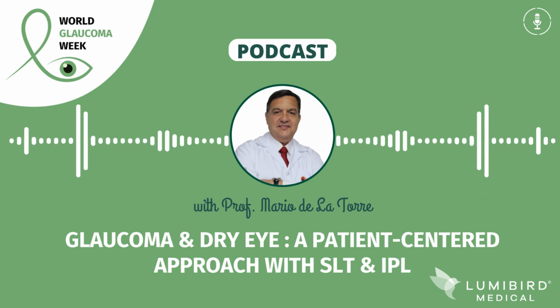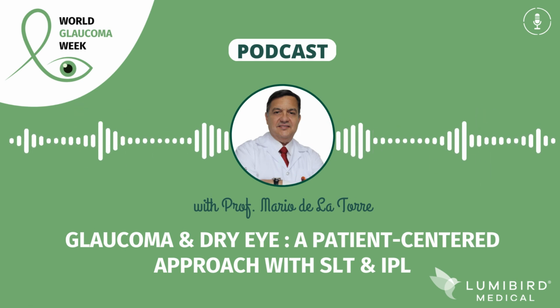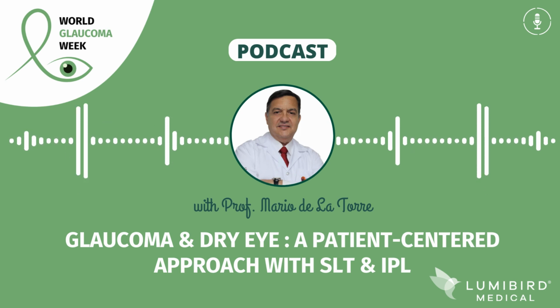Why? Anterior segment OCT is easy, fast, and the images are very nice, but the disadvantage is that we have only the vision up to the iris, and it stops there. We can't see what's happening just behind. Both are good methods, but they are complementary. The UBM provides better visualization of deeper structures, including the ciliary body and its processes. We can rule out other conditions very easily, tumors in the ciliary body, cysts, signs of inflammation, etc., that we are not able to see using optical media.